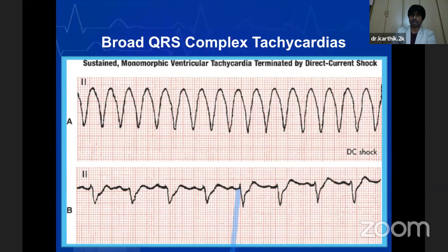Now, this is another lethal condition that we call monomorphic ventricular tachycardia. When you see such a rhythm, a wide QRS complex with a design pattern that looks the same from the origin till the termination, this is called monomorphic ventricular tachycardia. You usually see these rhythms in patients who have a massive myocardial infarction and patients who have electrolyte disturbances. When you see such rhythms, you should immediately give a DC shock to these patients, because these patients may not give you enough time to act and do anything else other than shocking them.